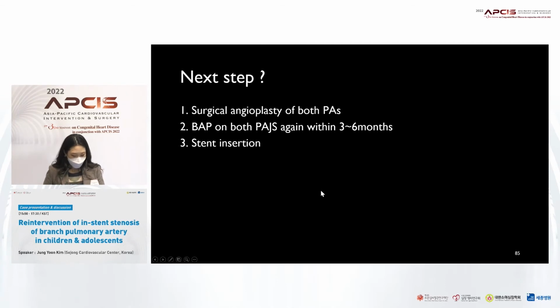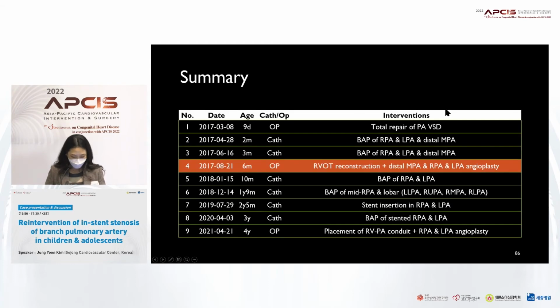I suggest 3 options here. Please give me your opinion freely, whether you agree with this opinion or not. So as mentioned earlier, unlike case 3, case 4 was treated with surgical angioplasty of both PAs. So I passed the discussion.